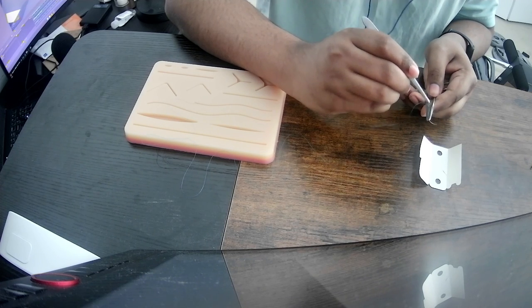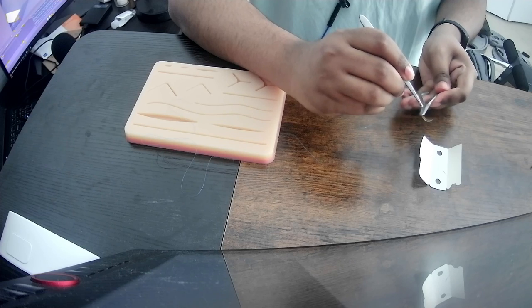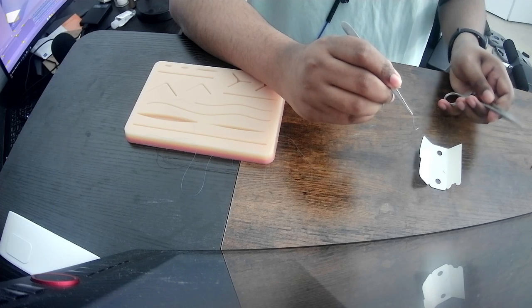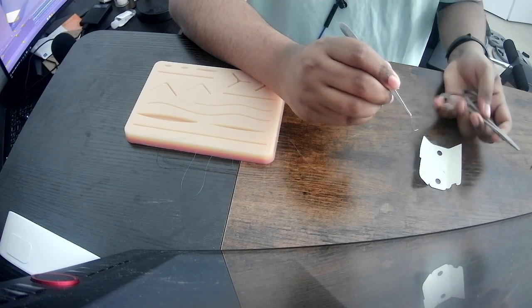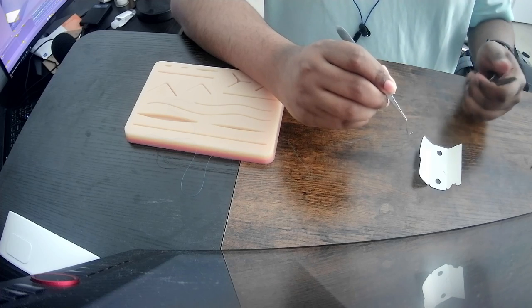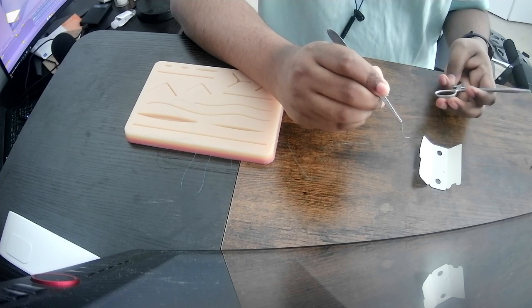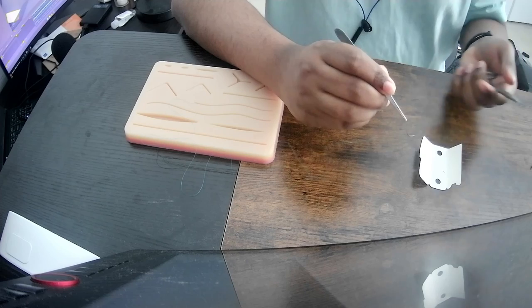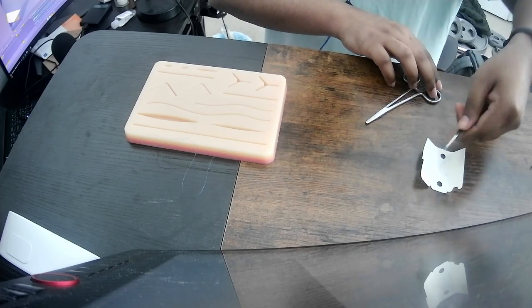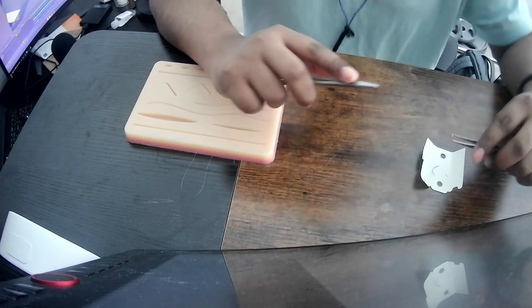Let me just hold the suture just in case the needle goes flying or something, some freak accident. Okay, there we go. Am I doing it too tightly? What's wrong? Yeah, man, it's hard. Doing it left-handed is harder for me. That's expected, though. Okay, let's load it again with the left hand. Oh, I did it too gently. I don't know, this feels terrible. Maybe I'm not ready for this yet. I'll just stick with one hand for now, and once I get good with one, I'll swap to the other. Yeah, I'm sticking with right-handed for my needle driver for now.